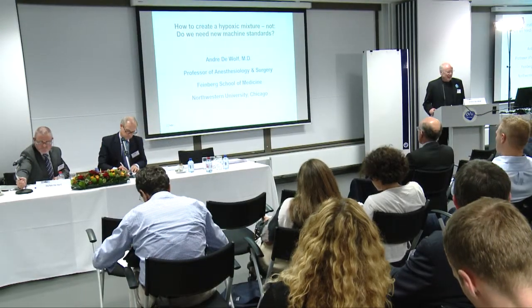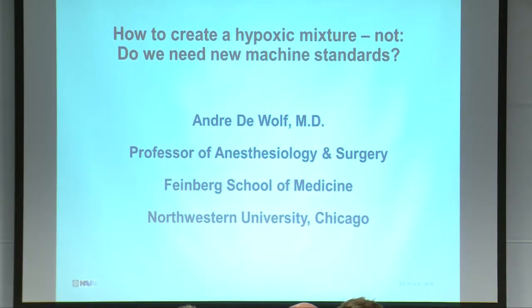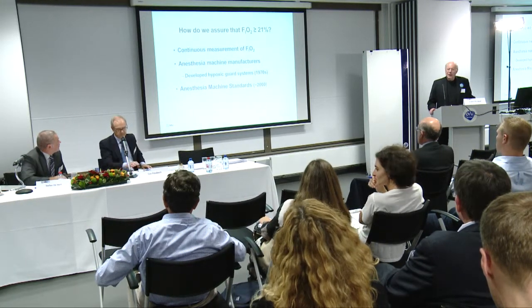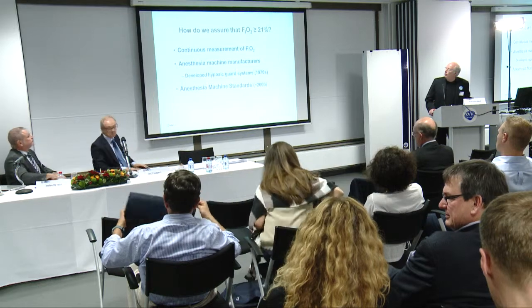Thank you very much. My talk is going to be about creation of hypoxic mixture in the anesthesia circuit, how to avoid it. So I'm really going to be talking about hypoxic guards. So how do we ensure that the FiO2 is higher than 21%? We have to administer enough oxygen to our patients. We should be doing continuous measurement of FiO2. That should be standard of care.